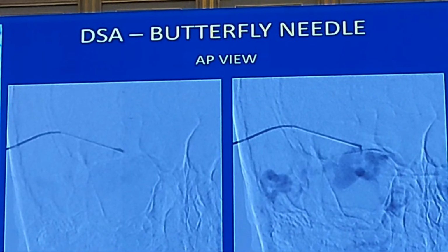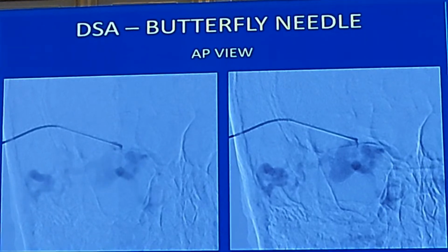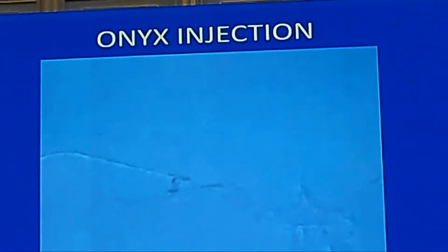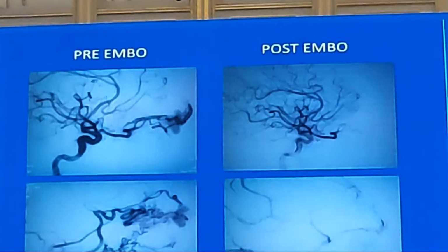That's a deep image showing the same, the venous drainage pattern. After that, we started our Onyx injection in this case.